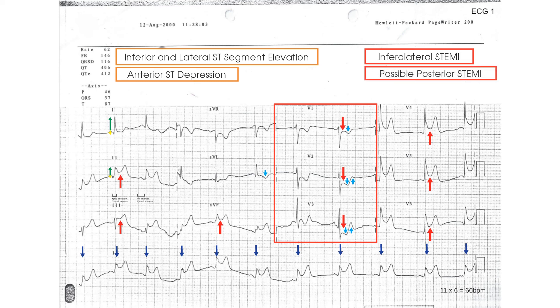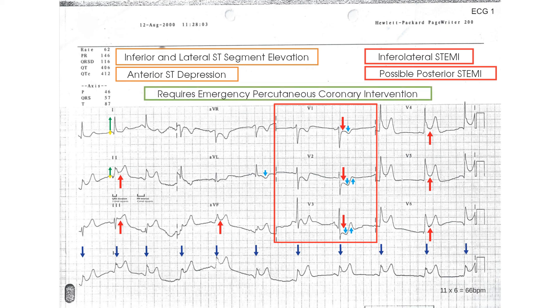Posteriorly placed leads, i.e. V7 and V8, may confirm this. Either way, the patient needs an emergency PCI.